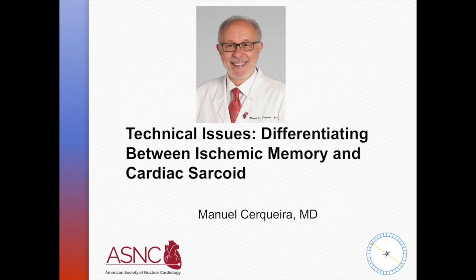Very good. So cardiac PET sarcoid studies in the right clinical context with the right preparation can give you very useful information for diagnosis as well as management. And we're starting to see a lot more people who don't tolerate the steroids very well, where they need to add additional immunosuppressive therapies that may give other problems. They're using the PET study to monitor them. Well, thank you very much, Aldo, for doing such a great job.